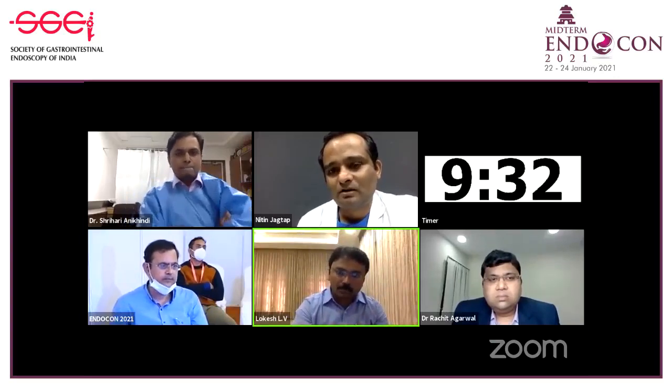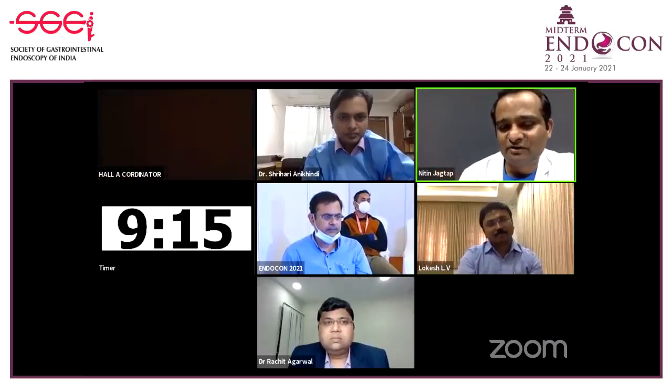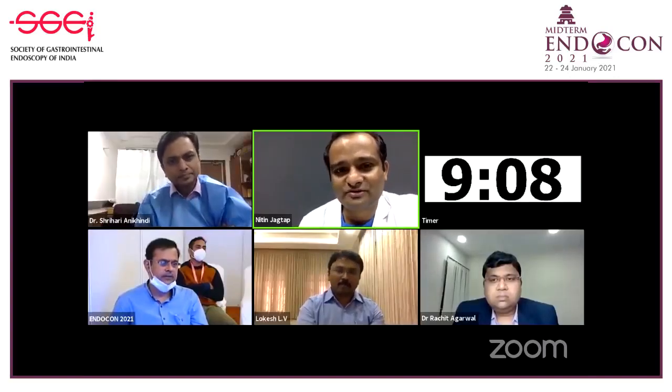Hello, Nitin. Excellent talk, Nitin. One thing, Nitin, do you do the entire procedure in retroflexion view, or do you use antegrade also? It's in retroflexion only, majority. So your APC probe is very close to the scope. So how about the scope injury? So we need to avoid that initial few mm of tissue, so that scope injuries should not occur. So you have to be cautious during that procedure.